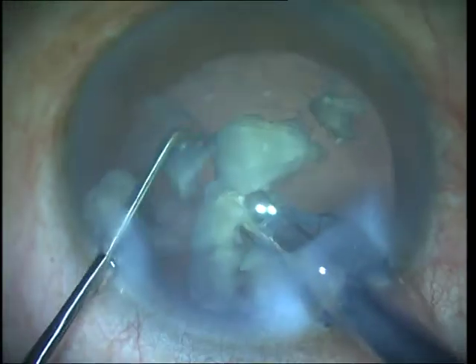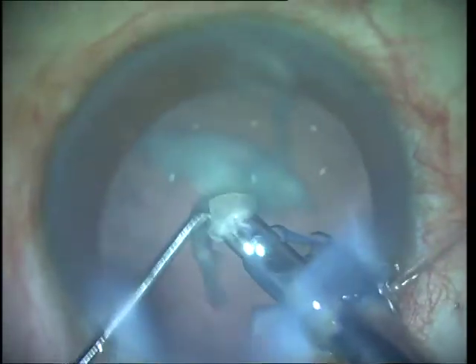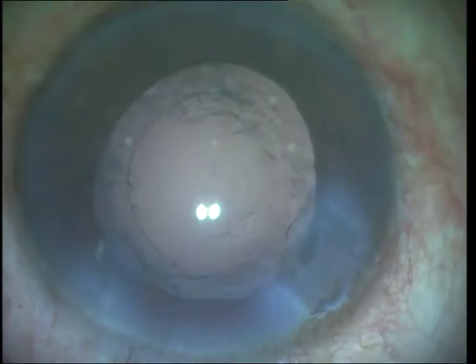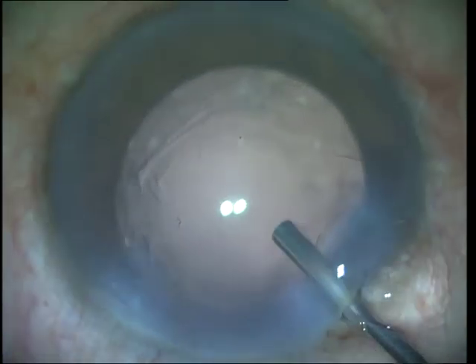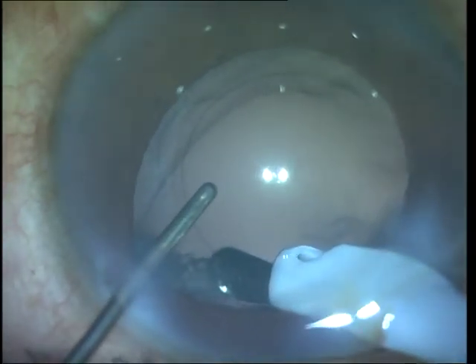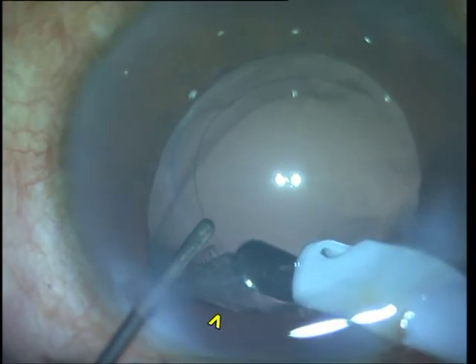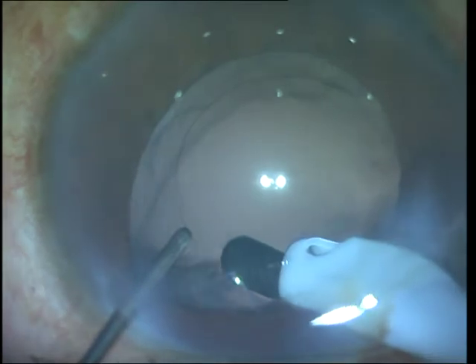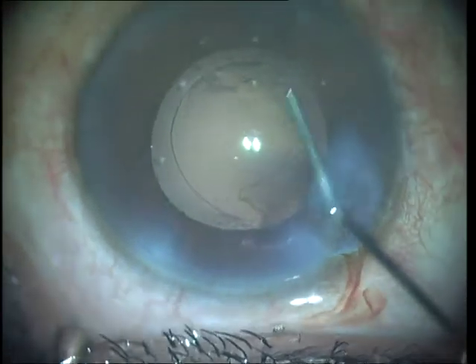This risk also exists because there is no epinucleus to hold the posterior capsule back in these cases and the zonules may also be weak. A lost chip should always be looked for, as there was one seen just below the incision. Cortex removal should be done with care. While trying to go behind a bit of cortex in the sub-incisional area, I accidentally caught the capsular fornix - you can see the fornix of the bag. In this case you should immediately reflux, release the capsular fornix, and proceed carefully so that zonulodialysis does not occur.